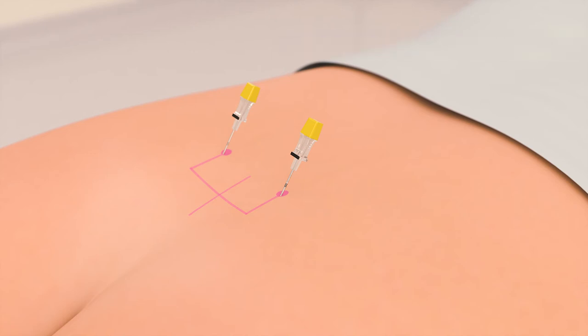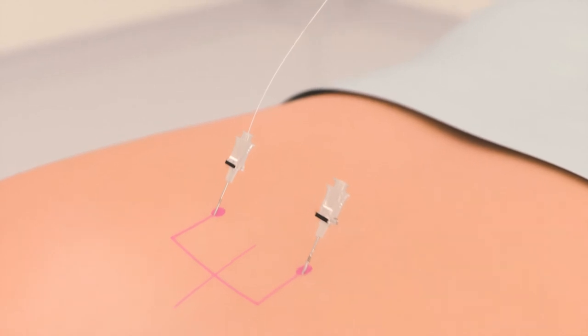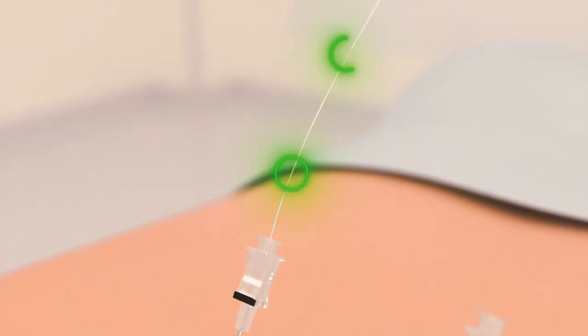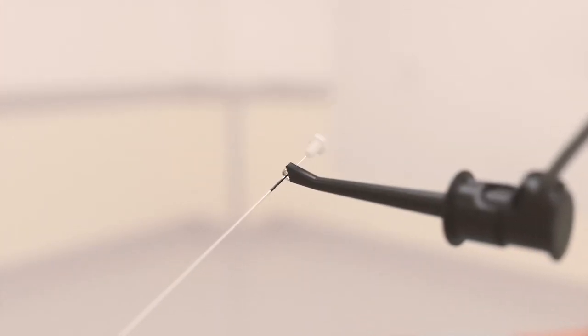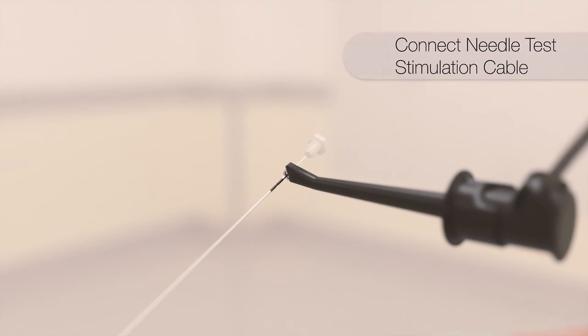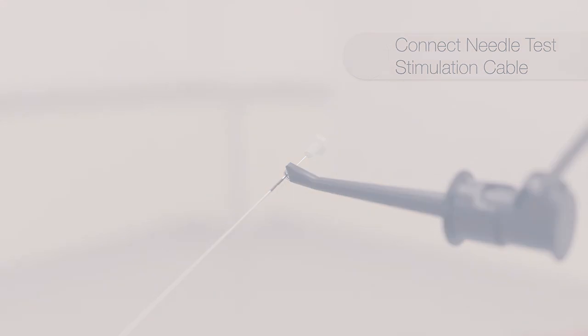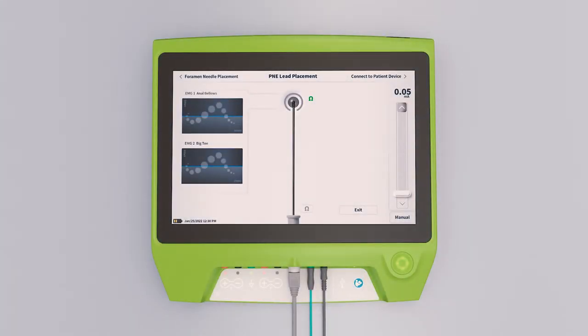The stylets from both foramen needles are removed. The PNE lead has two markings to signify the length of the short 3 1⁄2 inch needle and the long 5 inch needle. The PNE lead is advanced to the respective marker. The needle test stimulation cable is clipped to the uninsulated silver connector pin on the proximal end of the PNE lead. The clinician programmer is used to provide test stimulation to confirm sensory and motor responses.